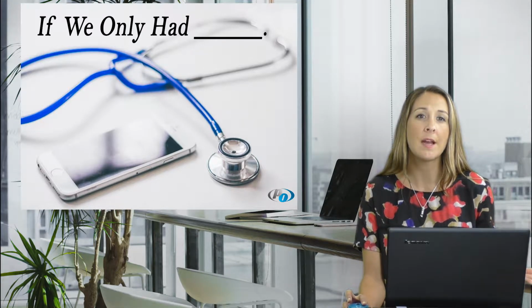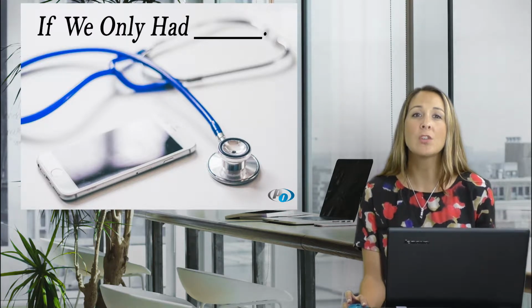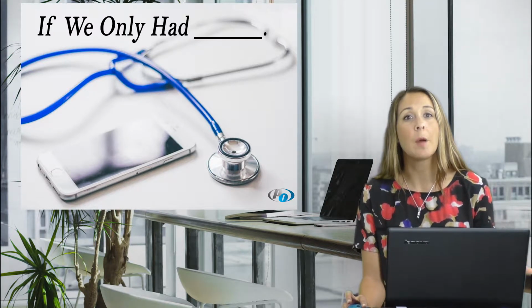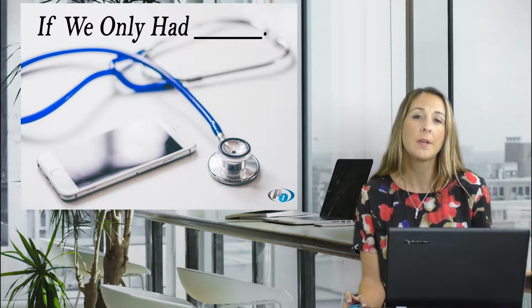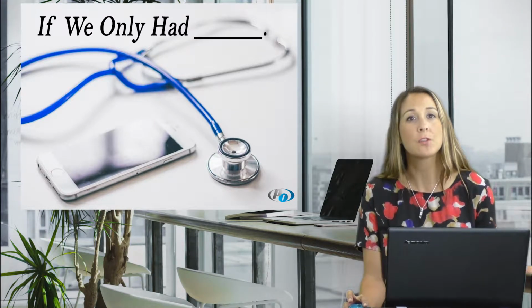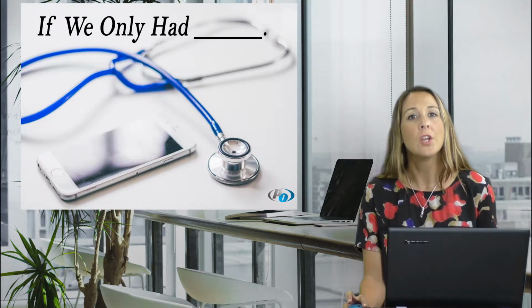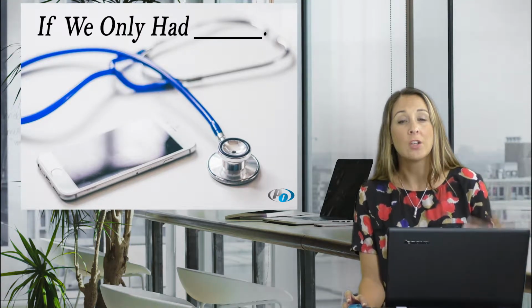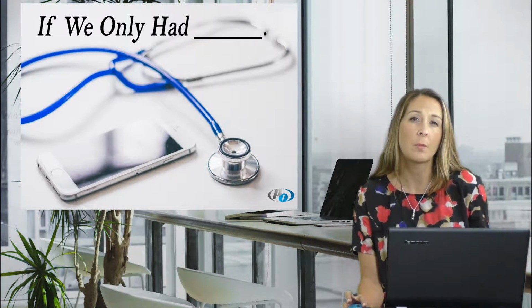But look forward to our other webinars that may go into Pro 8, which one of the things that I love about Pro 8 is that you can record yourself conducting a video analysis. And then if you want, you can upload that to the cloud and use that in your discussions with your mobile analysis app. There are some great features of using that, because if you're trying to explain to a physician why you are making clinical decisions, you can do that within that application. You can draw on it and speak to what you're seeing in your observations.